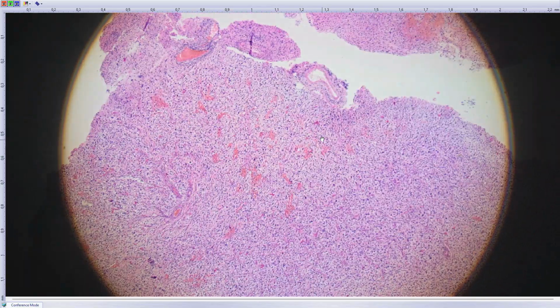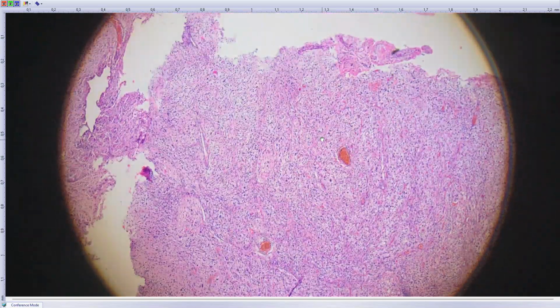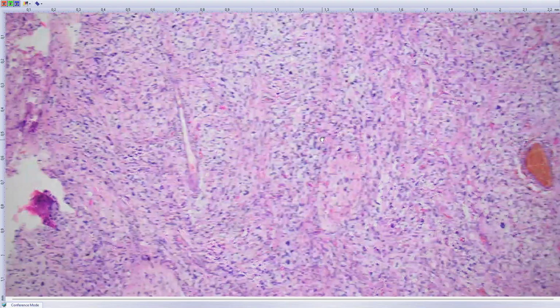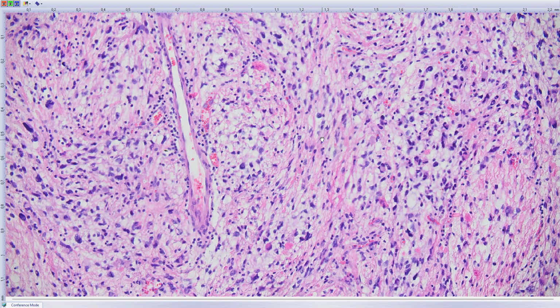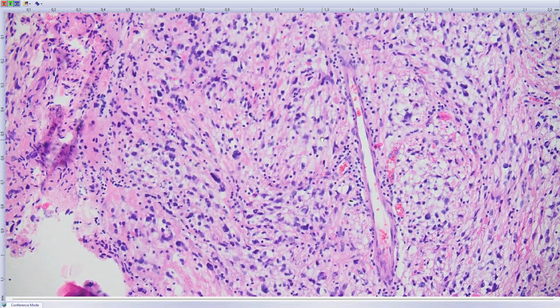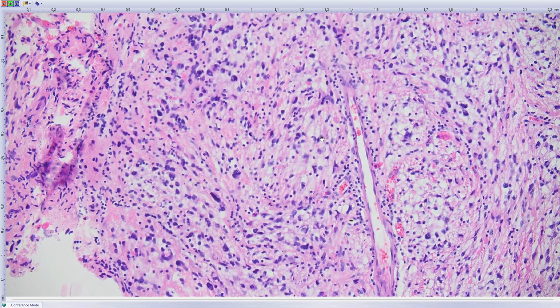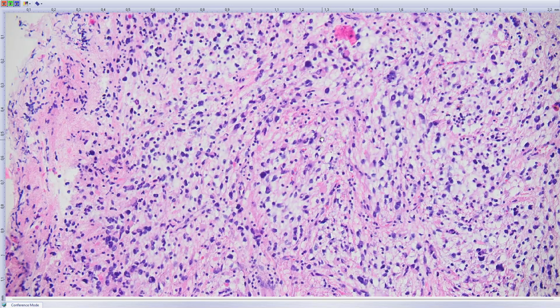It's very cellular, but still in my eyes a little bit piloid looking. It's composed of these cells. Some of them have really long processes, and some cases of pilocytic astrocytomas may have these ugly looking nuclei, and it's similar to schwannomas, where you may have these ancient atypical nuclei.